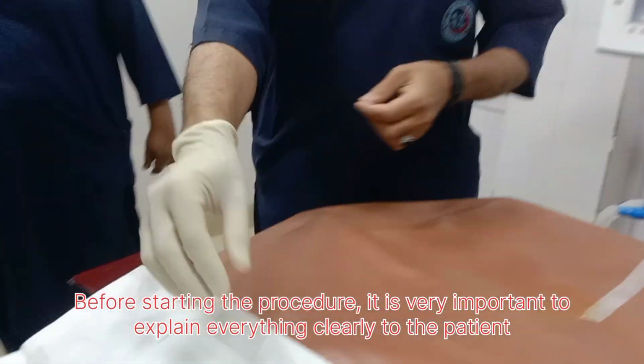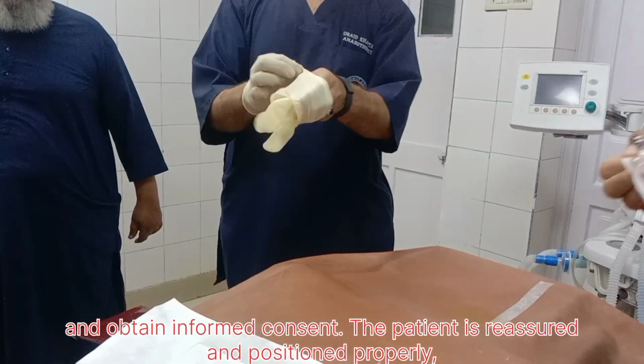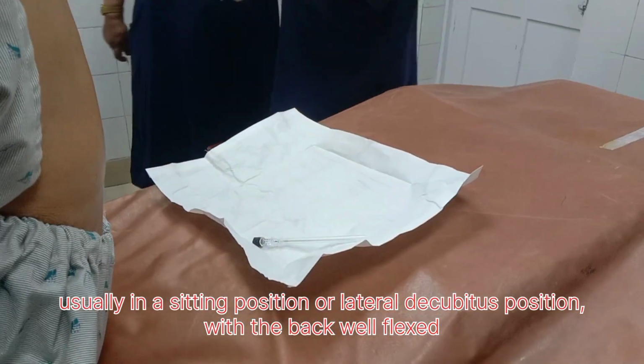The patient is reassured and positioned properly, usually in a sitting position or lateral decubitus position, with the back well flexed to open up the intervertebral spaces. Strict aseptic technique is essential.